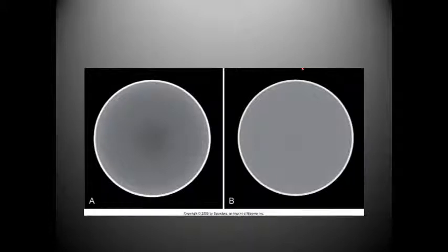So, what happens as a result of beam hardening is this.